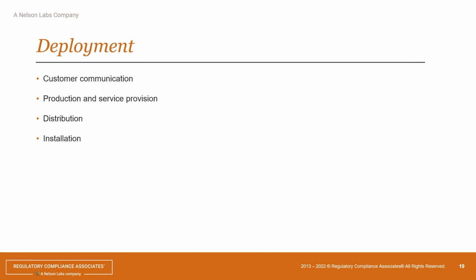So now we have software that has gone through all the activities. We have verified and validated it. Now it's about the deployment. And as I said before, in software, depending on how we do this, if it is deployment through the internet and we have a connection to the devices, etc., we've got to be careful in the sense that there's cybersecurity.